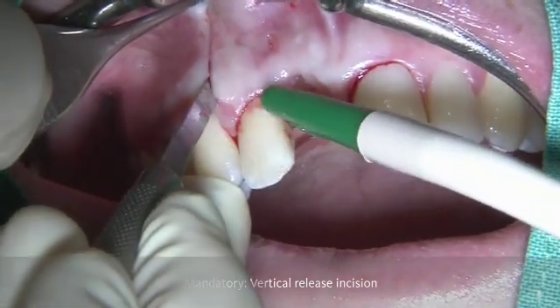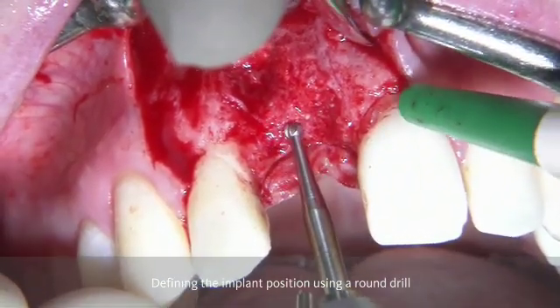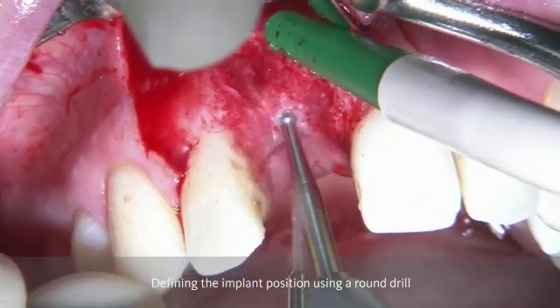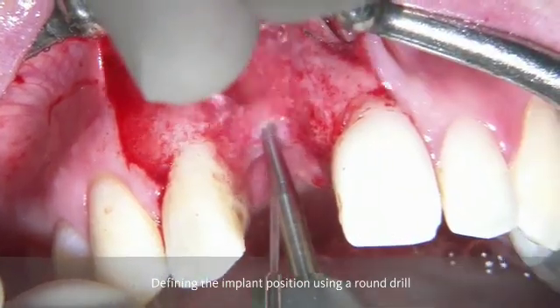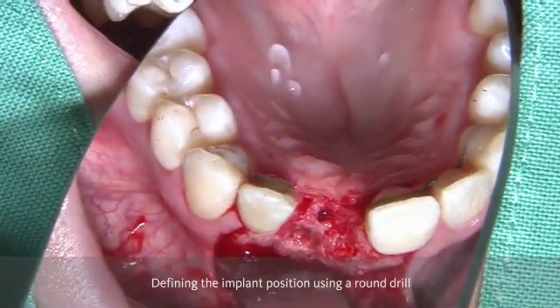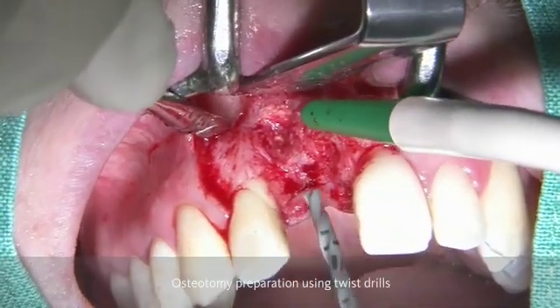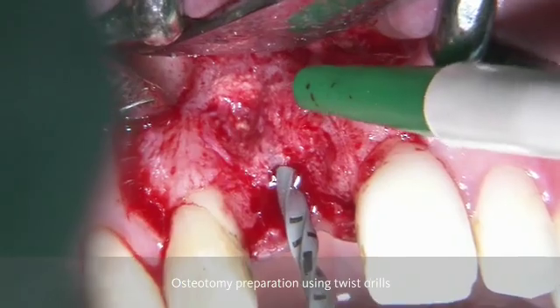With this approach, we are able to have ideal visibility of the area where the implant needs to be placed. As a first step, the implant position is going to be defined by using a round drill and checking its position. Then it follows by using the twist drills in order to prepare the osteotomy for the implant.